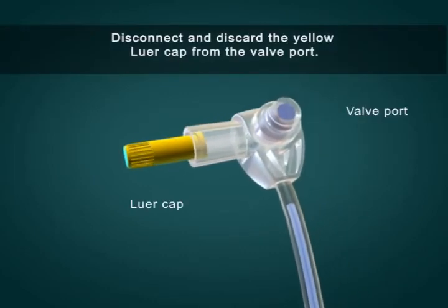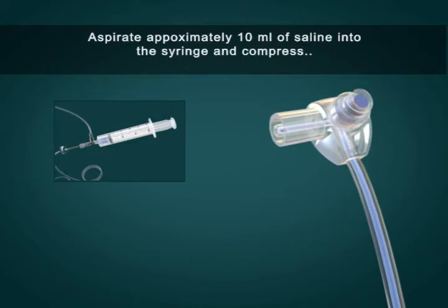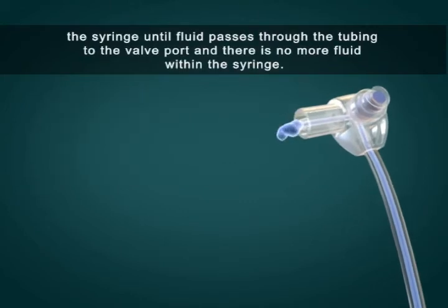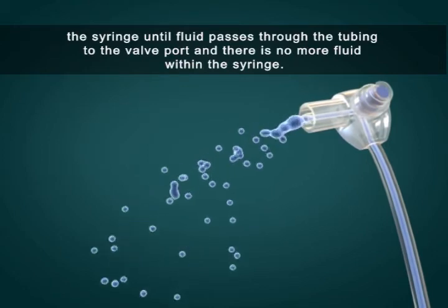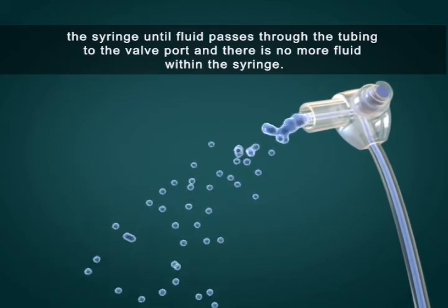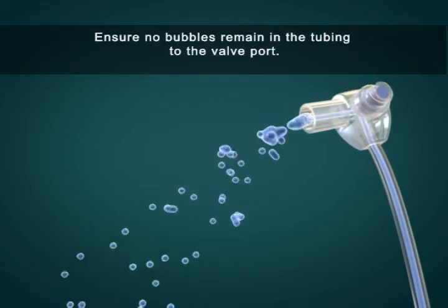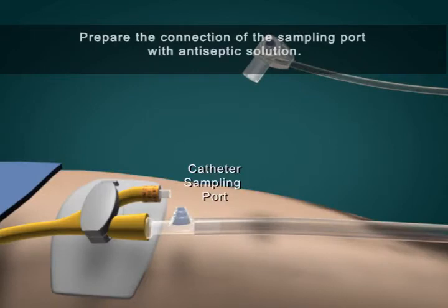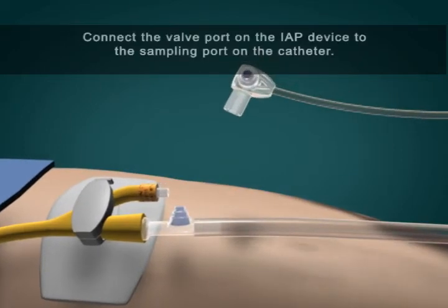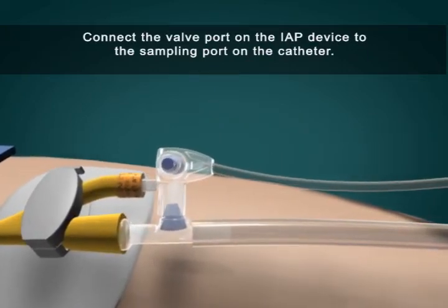Disconnect and discard the yellow luer cap from the valve port. Aspirate approximately 10 milliliters of saline into the syringe and compress the syringe until fluid passes through the tubing to the valve port and there is no more fluid within the syringe. Ensure no bubbles remain in the tubing to the valve port. Prepare the connection of the sampling port with antiseptic solution. Connect the valve port on the IAP device to the sampling port on the catheter.